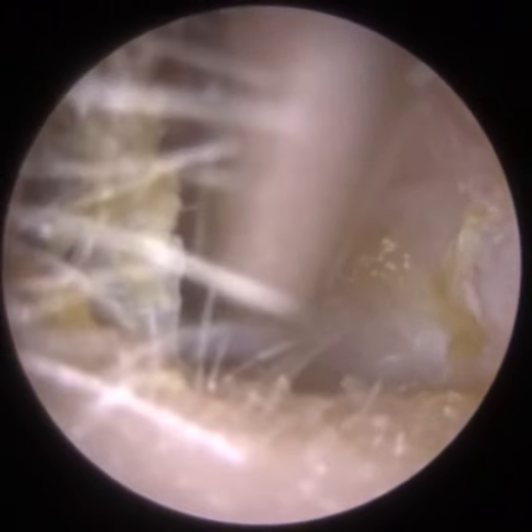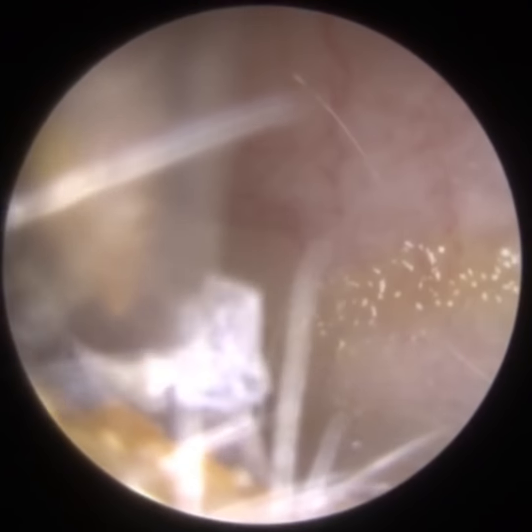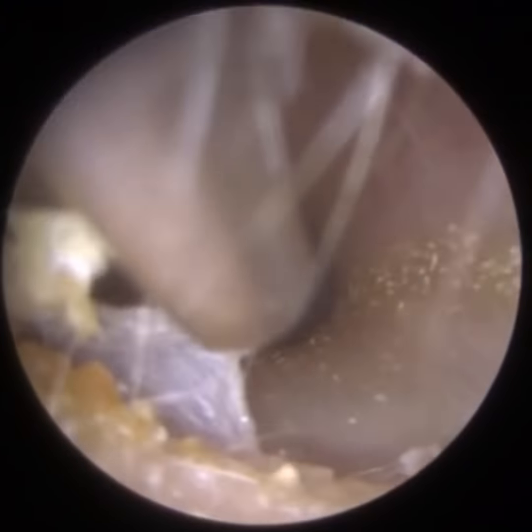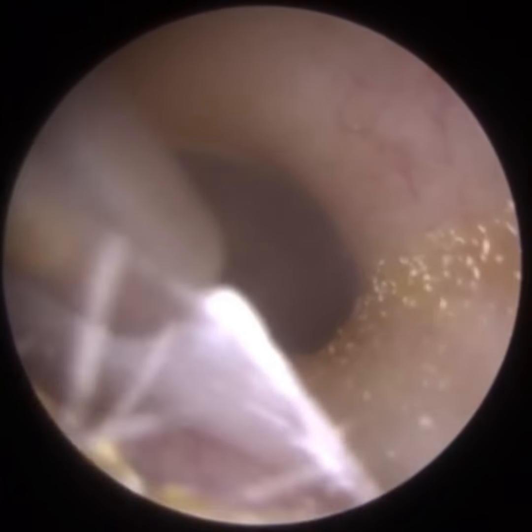Just waiting for you to get a better view. So can you see that on the right hand side? You can see there's a trail of skin, like a footpath that goes to the eardrum. So that's the natural migration route of the skin from the eardrum, and it's slowly trying to come out of the ear canal. Because of the psoriasis, the eczema, the otitis externa, this skin has remained there.